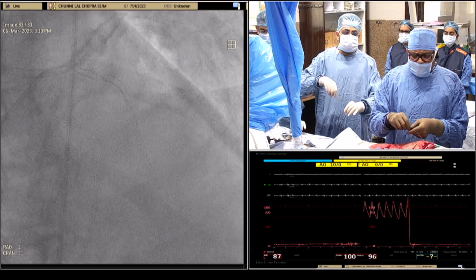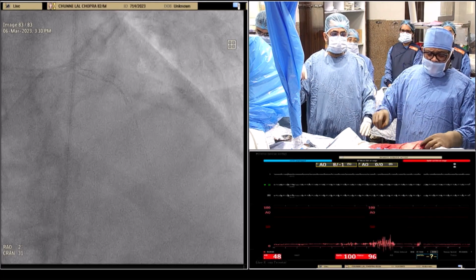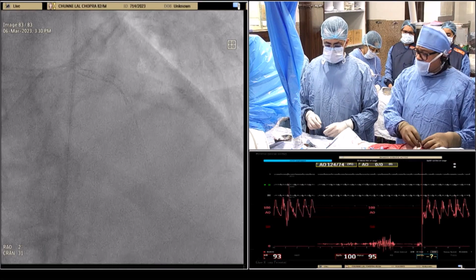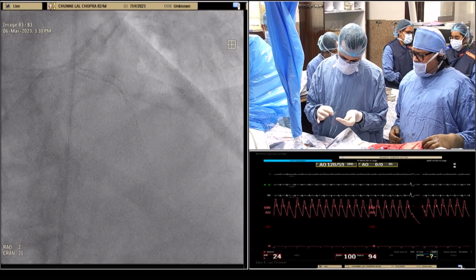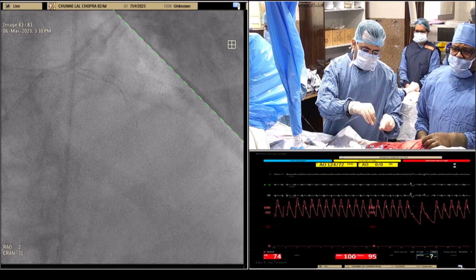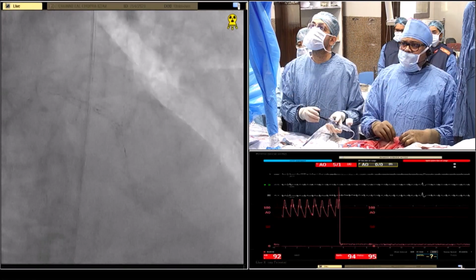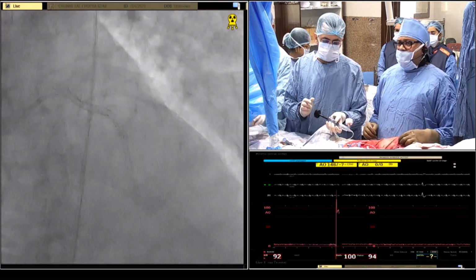And let me dilate it further with a 3.5 millimeter balloon just at the origin of the diagonal, and then proximally followed by say a 4 millimeter NC balloon in the proximal segment. So kindly give me 3.5. The distal 5 mm of the previously deployed stent is of 3 millimeter, and the rest of the proximal segment is of 3.5. So let me dilate from that particular point proximally. So this is the previously deployed segment, and let's dilate it.